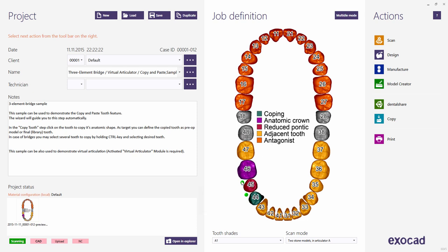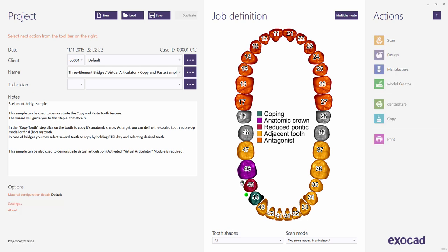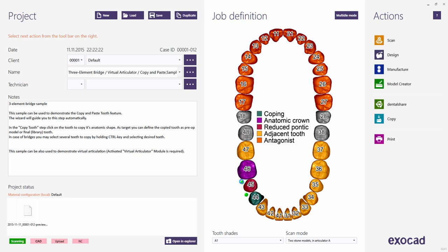By default, connectors will be set automatically whenever you define a pontic, and thus the toggle buttons are colored in green. Click to toggle — the color will change to gray and no connector will be created. In practice, you will use this feature mostly to add connectors between adjacent crowns or copings. Click again to create a connector. Note that if the color button is red, a connector may not be created because the material of the adjacent teeth differs. And if no toggle button is present, one of the selected types does not permit connectors.